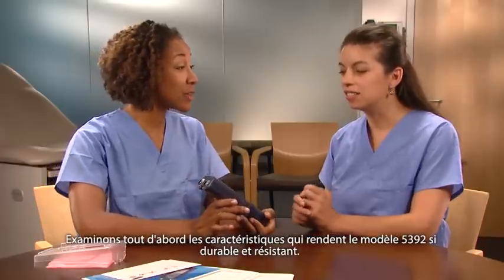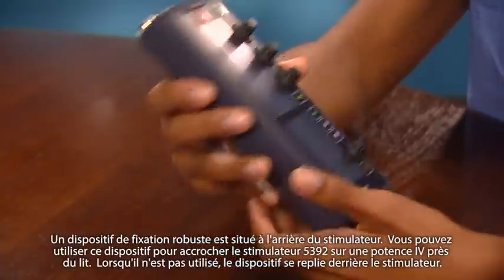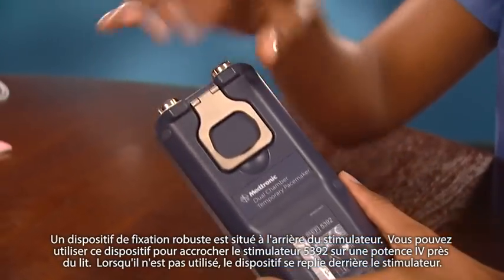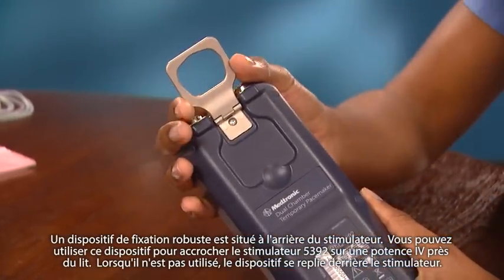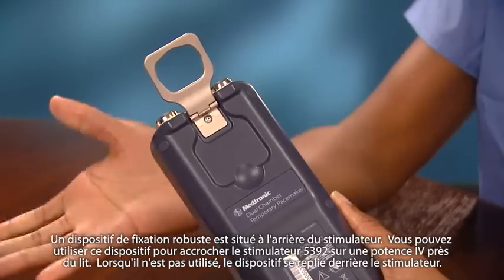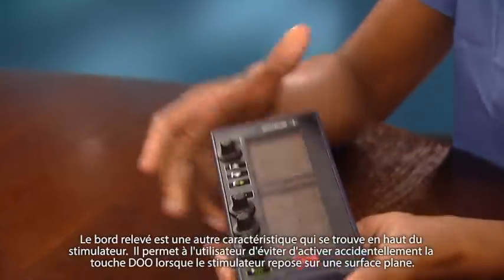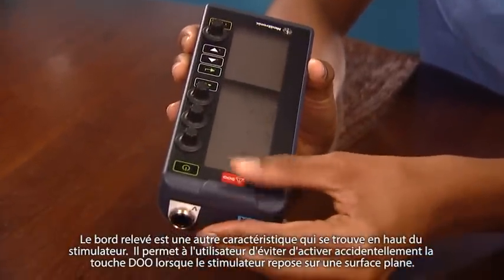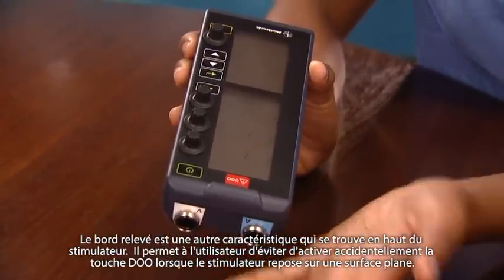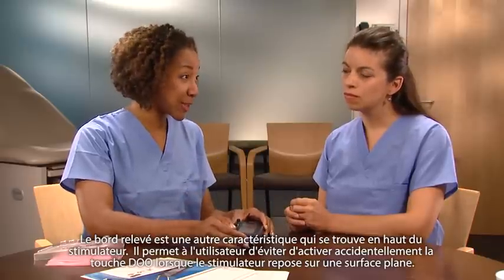Let's review the features that make the 5392 so durable and damage-resistant. A robust attachment ring is located on the back of the device. Use the ring to hang the 5392 on a bedside IV pole. When not in use, the ring folds flat against the back of the device. Another feature is the raised edge at the top of the device — it helps the user avoid accidentally pressing the DOO key while the device is lying on a flat surface.